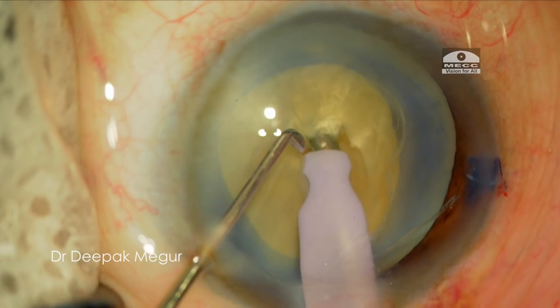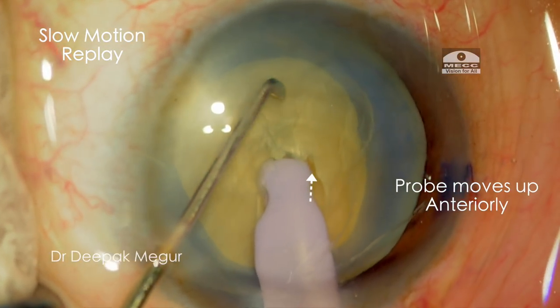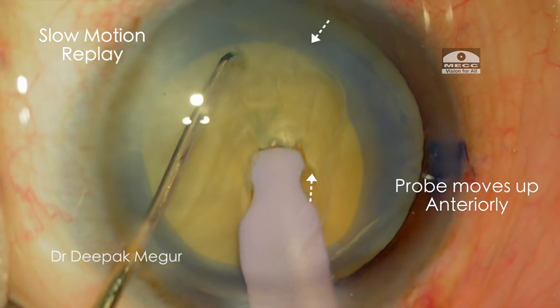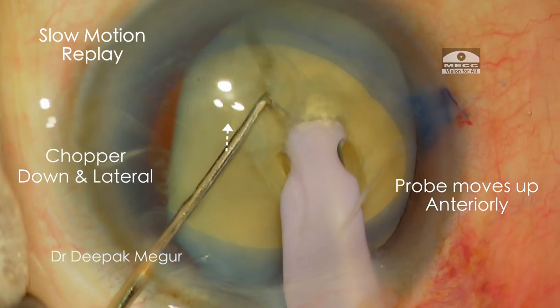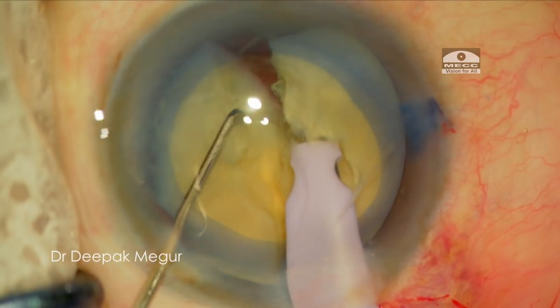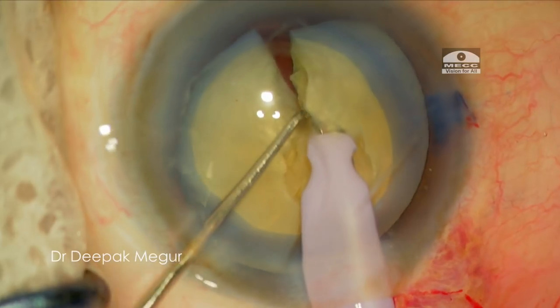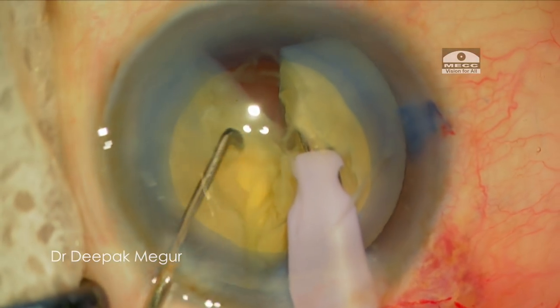Let us go back and see the two movements which I made for the vertical chop. So once I bury my tip, the right hand moves up lifting the nucleus slightly. I get this confirmation by seeing that the nucleus is touching the anterior capsule, and simultaneously my left hand moves down and then laterally out. By this manoeuvre, we can ensure that the posterior capsule and the zonules are not put at stress during the chopping manoeuvres.